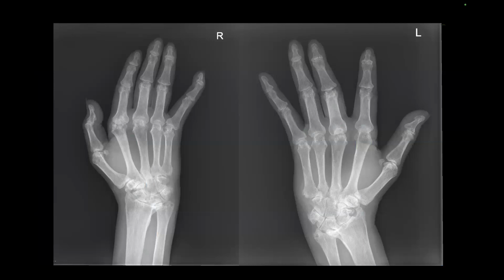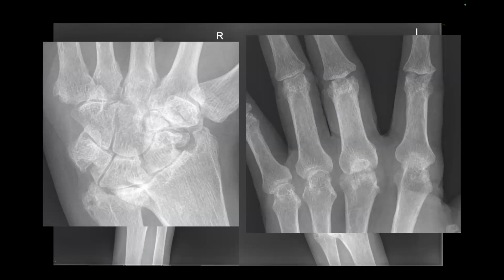So this is a pretty classic exam case of rheumatoid arthritis. We have a proximal distribution, so involving the radiocarpal, the midcarpal row, MCP, and also the PIP joints. And we see that there is quite a lot of erosions as well as subluxation. And just to zoom up there, you can see these erosions here at the joint surfaces, particularly quite a lot of changes around the ulnar styloid, which is often prone because of the amount of ligaments that are attaching to that and the large surface area that it's prone to the bulky synovitis. And then we have the subluxation across the MCP joints.